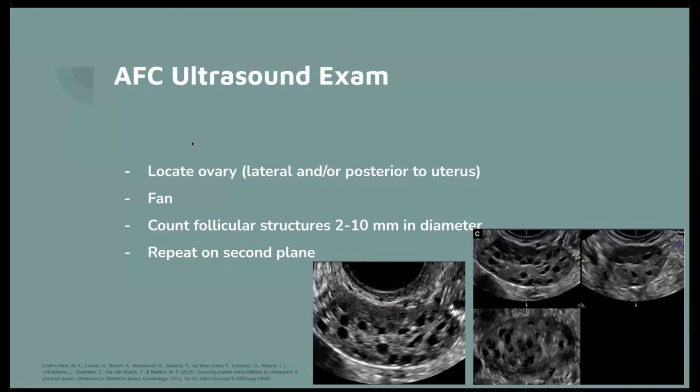You will find the ovary and fan through it, trying to find your best view — either longitudinal or coronal — where the ovary takes up at least 50% of the screen. As you fan through the ovary, count each follicular structure that is 2 to 10 millimeters in diameter. Antral follicles can be less than 2mm, but it's hard to differentiate those from other structures, so for consistency it's best to use the 2–10mm cutoff to ensure you're not counting something smaller.